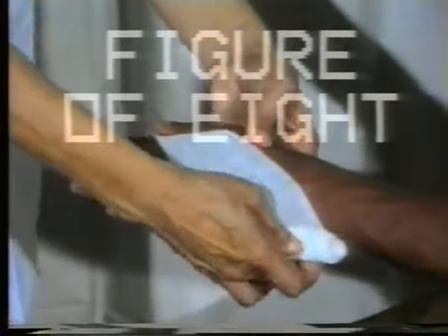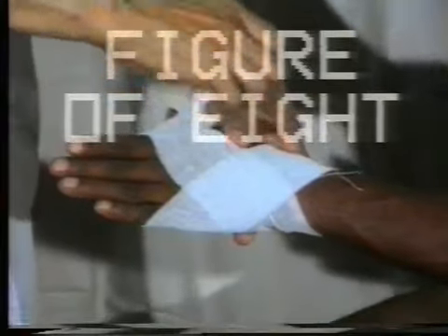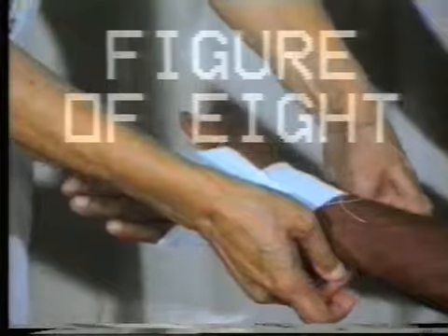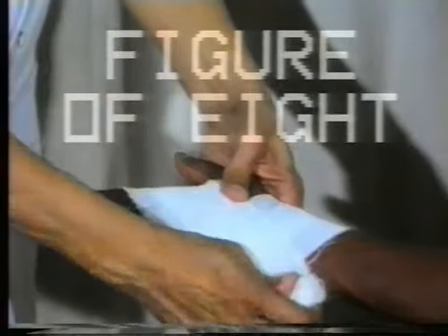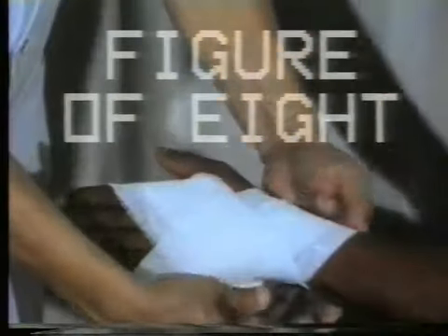Figure of 8 bandage is specifically used over joints. Here the bandage is applied alternately, once above and once below the joint, crossing the joint obliquely with each turn. The loops of the bandage so formed will look like a figure of 8. The figure of 8 bandage restricts the movements of the joint on the side where the bandage crosses it.